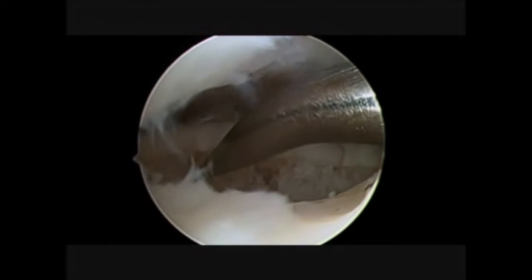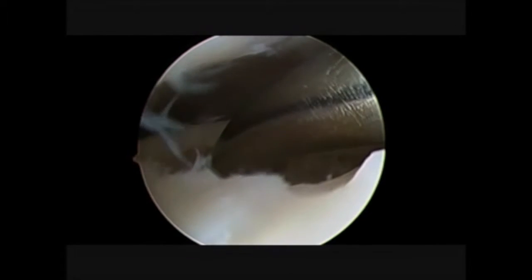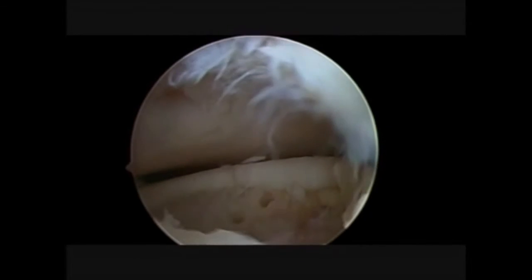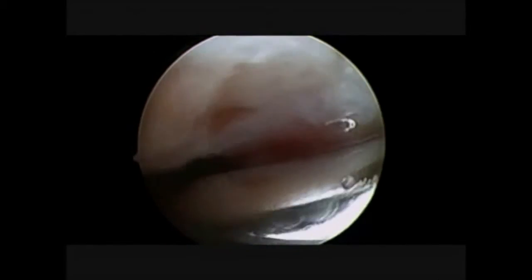We need microperforation and bone marrow stimulation. That's why in this surgical step we are performing microperforation all around the lesion. Microperforation is our last surgical step with water.